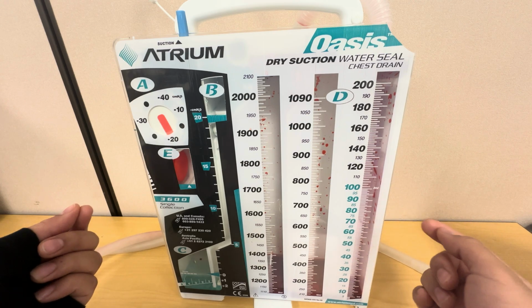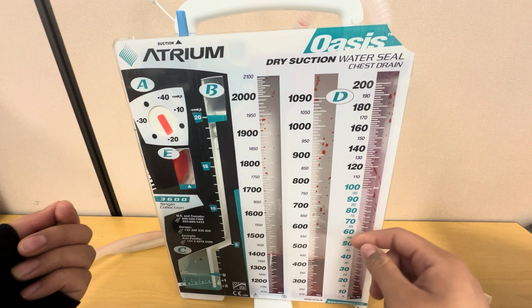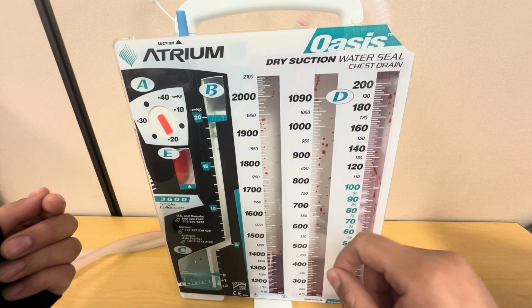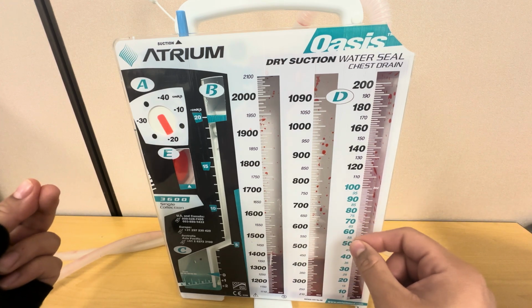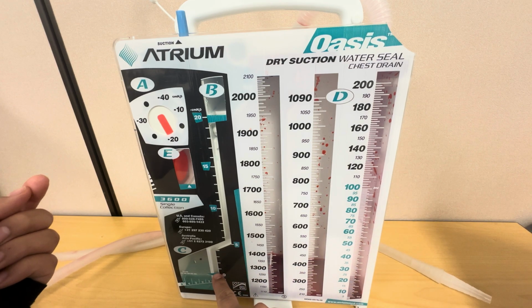So as a nurse, what we want to do is document the consistency, the color, and the amount. So we usually have this all marked up with different dates or times and initialed by the nurse that took the measurements. Here we have an air leak monitor.